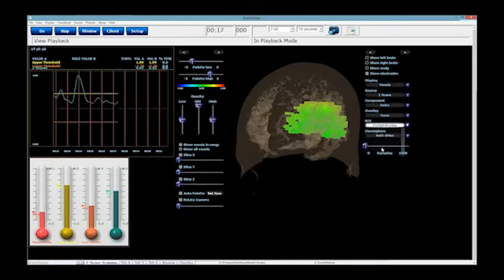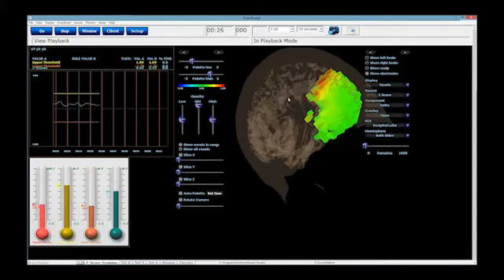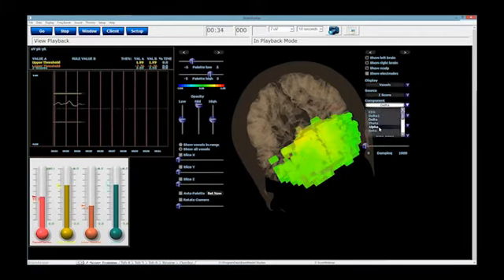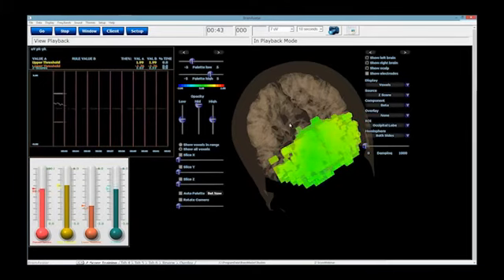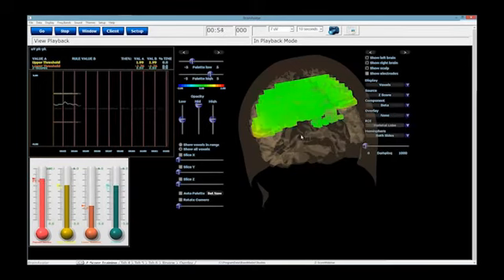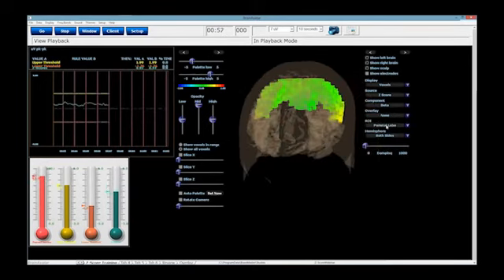Now with Select ROI built in, watch, I'm going to switch this. You see how you got a little bit of a change going on right now? Those numbers aren't quite as high. Well, now we're looking at the occipital lobe. And now we are actually training the occipital lobe, and we're training the delta. Now, what if I switch this to beta? You're going to notice it changed even more. It's moving basically a little bit quicker up and down more and more. That's because right now those components that I put in, select band and select ROI, are basically taking whatever I'm selecting right here, and they are training it. That is the value coming in.